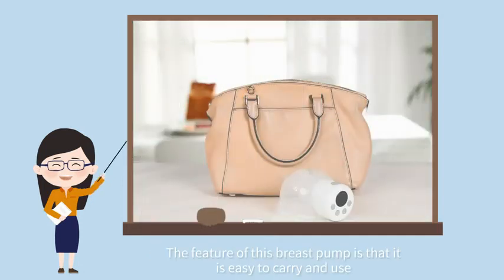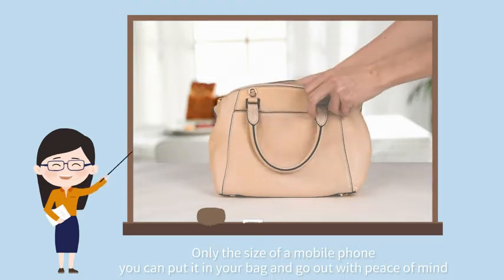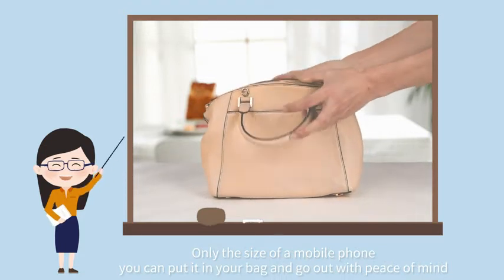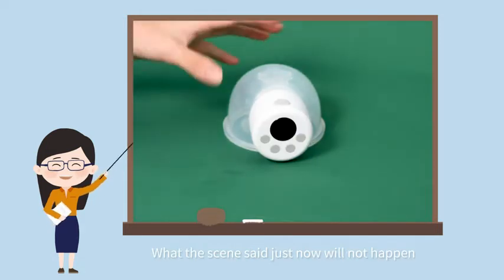The feature of this breast pump is that it is easy to carry and use — only the size of a mobile phone. You can put it in your bag and go out with peace of mind. That embarrassing situation will no longer happen.